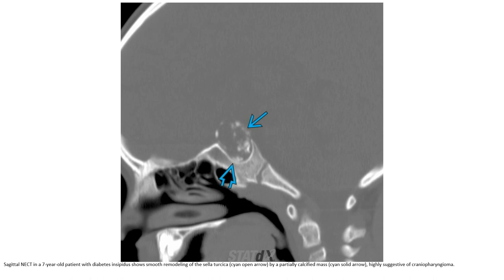This is the non-contrast CT in a seven-year-old patient with diabetes insipidus, showing smooth remodeling of the sellar dorsum by a partially calcified craniopharyngioma. This is highly suggestive of craniopharyngioma.